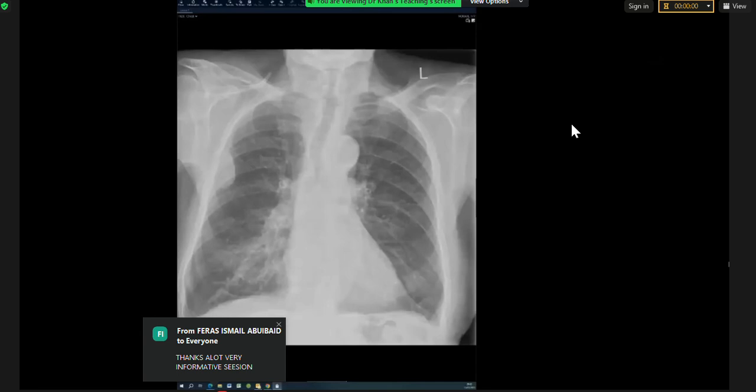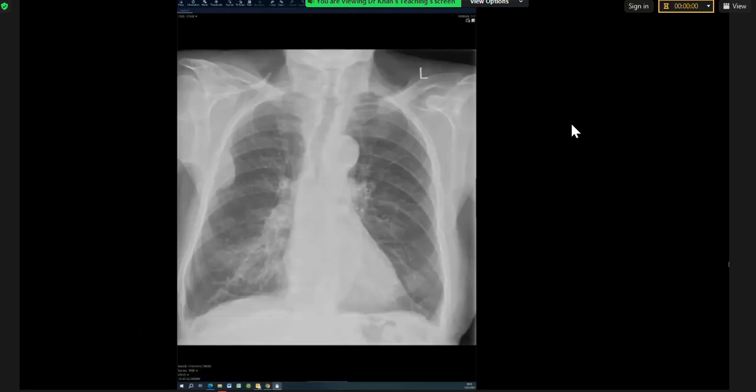Okay, the first question is, I have a question about the miliary TB case. On the CT, there was a mention about tree and bud, but the diagnosis was miliary. I think the word is miliary, and you're writing military, so that's one thing to correct. We have to call it miliary TB. Miliary TB is, like you said, hematological spread. When somebody is immunocompromised, they have a bit of everything going on, and this patient was actually reacting to a drug as well. So this was a mixed diagnosis of hypersensitivity with superadded atypical infection.